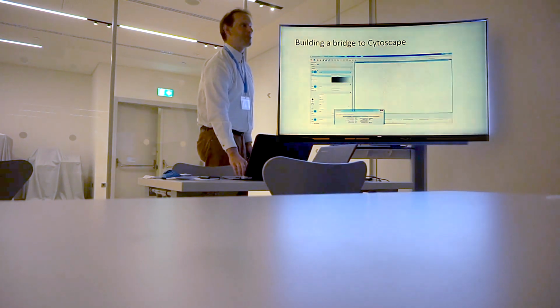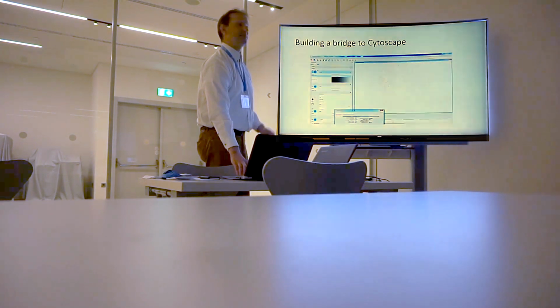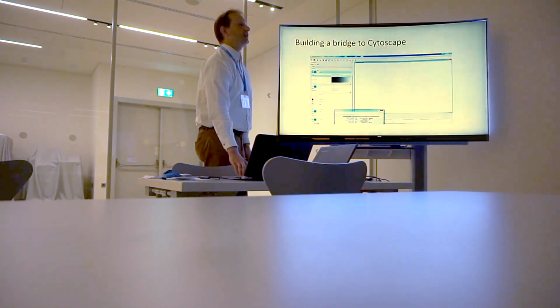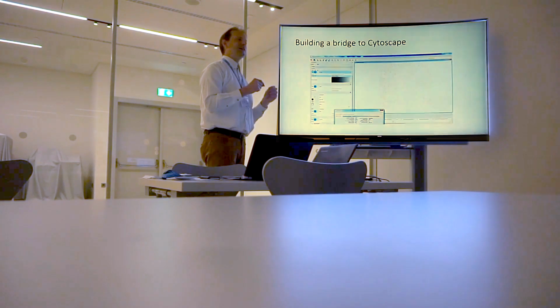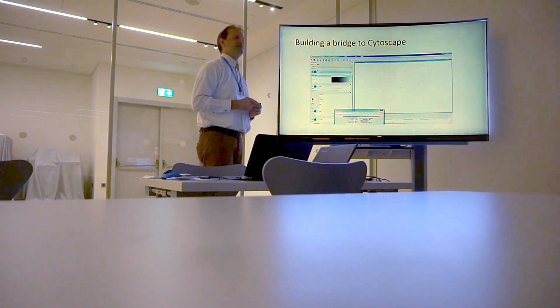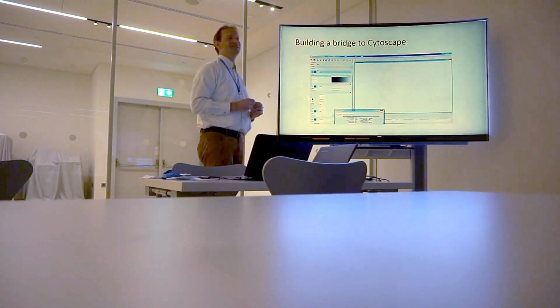But is this a two-dimensional embedding or just raw data in XY locations? Yes, this is just not raw data. An embedding of this high-dimensional graph in the two-dimensional space. So there are no properties of the graph that were studied and then embedded? Yes, there are. There are external, because the raw file, but I knew that was possible. The raw file has an XY coordinate, and then for every marker, there's also an expression value. This is fluorescence data coming out of a BD FACS.